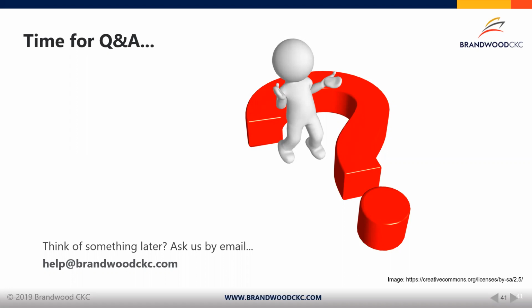Yeah, I completely agree. Because of the time at which the regulations were written, the waterfall model is a more traditional way of demonstrating compliance. However, as Yervant has mentioned, Agile is compatible with those methods. I think the key in a regulatory application is to clearly demonstrate through your documentation that you've got full coverage of validation activities. Yep, that's right. So at the end of the process, if you can demonstrate that all of your inputs have been met, whether you've used an agile methodology or a more conventional way of design and development, both would be satisfactory. You just need to show that all inputs and the full coverage is provided, and that your verification and validation activities are complete.